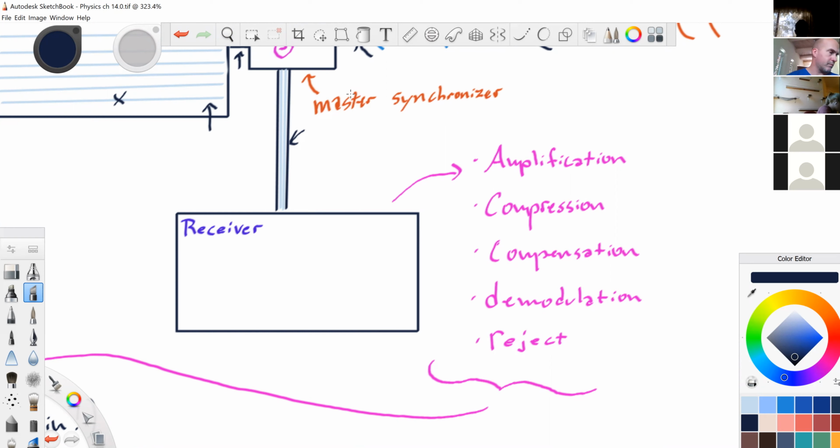We have control of the amplification because each mode, CW, wait, no, PW, no, that's pulse wave, color, 2D, I can't remember what they all say, but we want to turn up our color amplification.